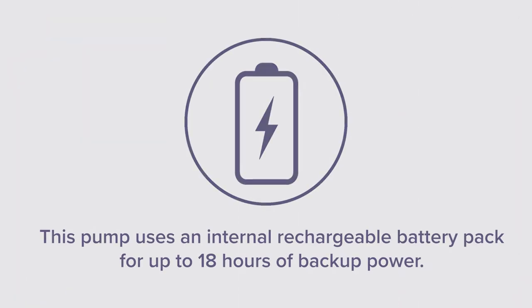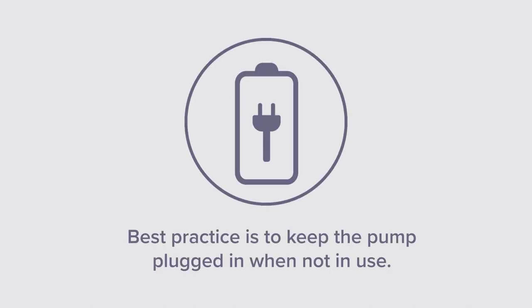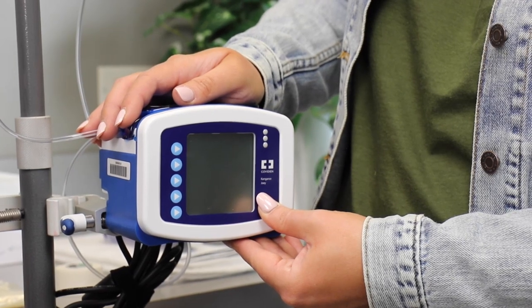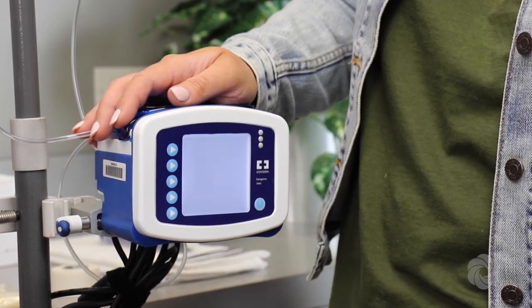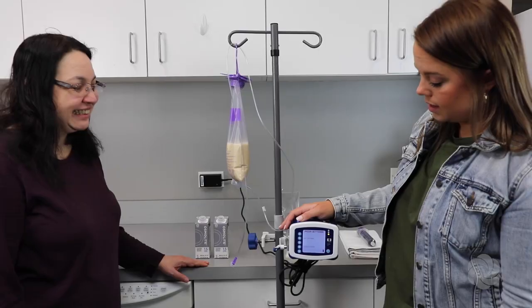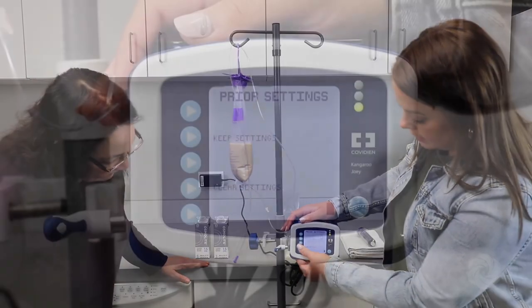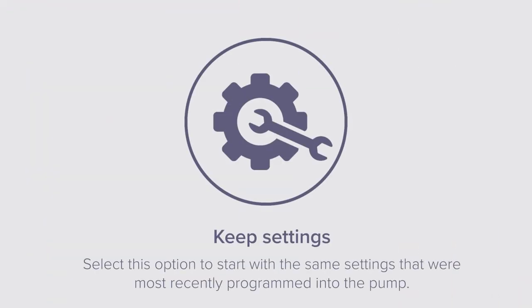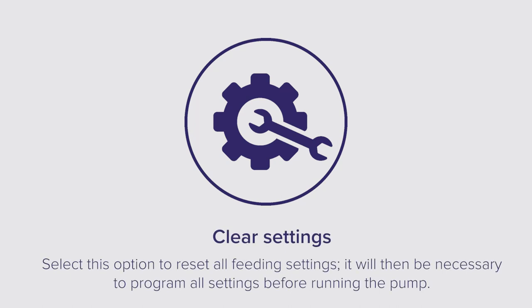This pump uses an internal rechargeable battery pack for up to 18 hours of backup power. Best practice is to keep the pump plugged in when not in use. Turn the pump on by holding down the power button located on the bottom right corner of the pump for 3 seconds before letting go. Press the corresponding menu selection button to keep settings or clear settings. Select the keep settings option to start with the same settings most recently programmed into the pump.